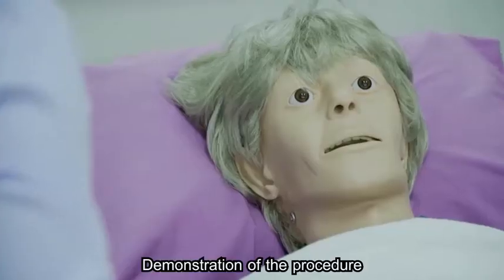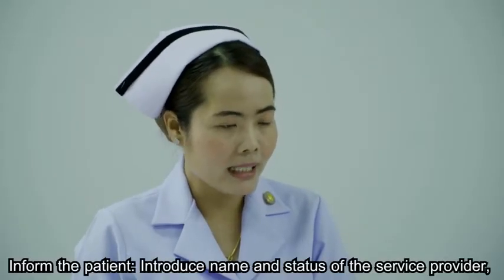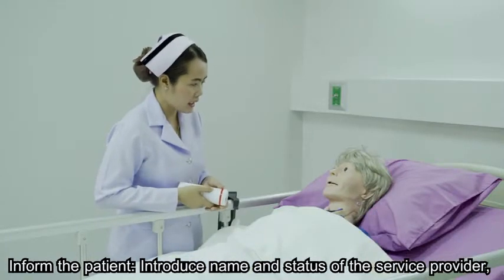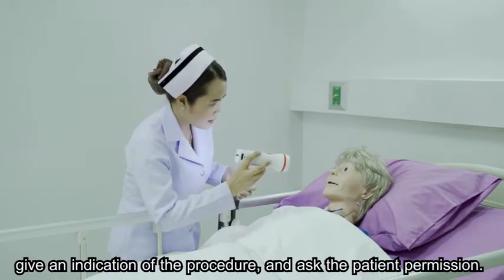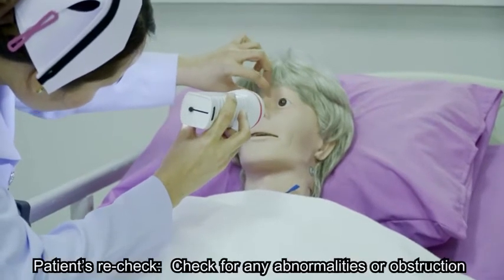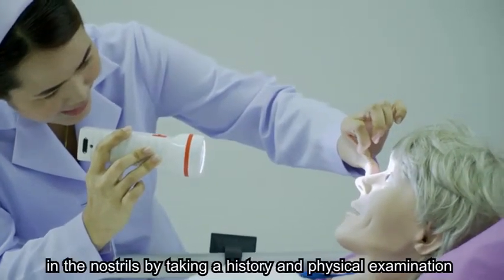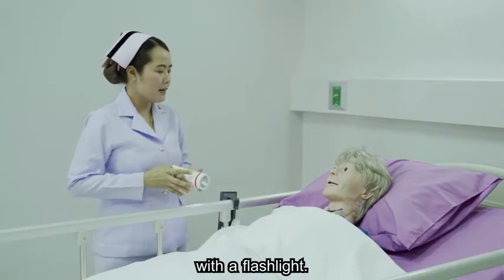Implementation, demonstration of the procedure. 1. Inform the patient. Introduce your name and status as the service provider. Give an indication for the procedure and ask the patient's permission. 2. Patient's recheck. Check for any abnormalities or obstruction in the nostril by taking a history and performing a physical examination with a flashlight.